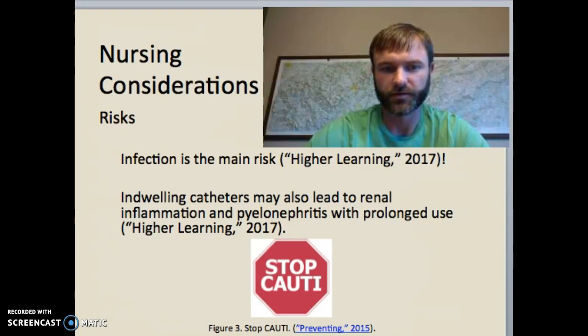Also, indwelling catheters may also lead to renal inflammation and pyelonephritis with prolonged use.